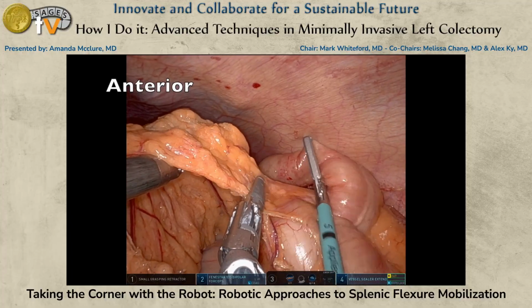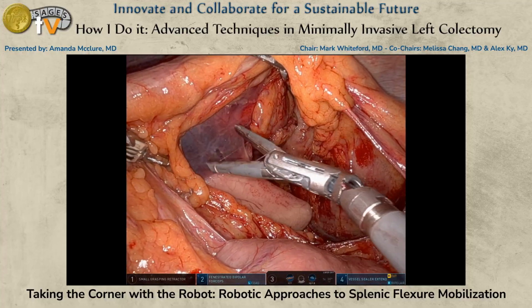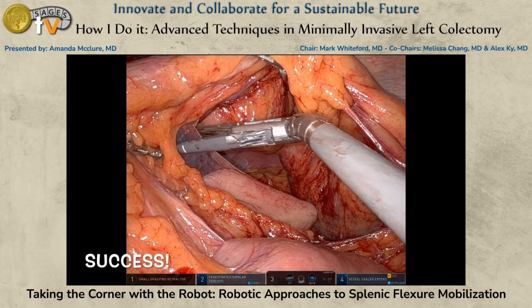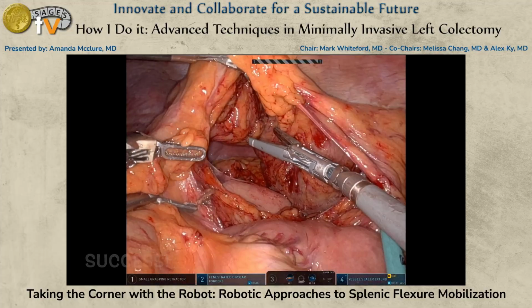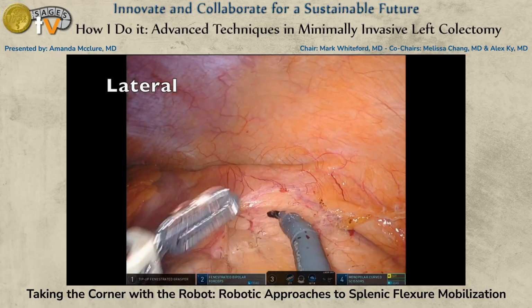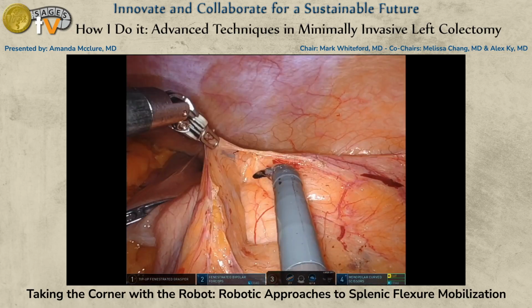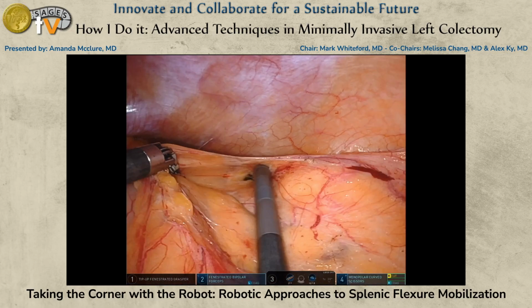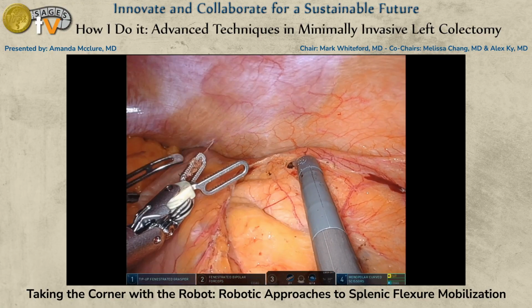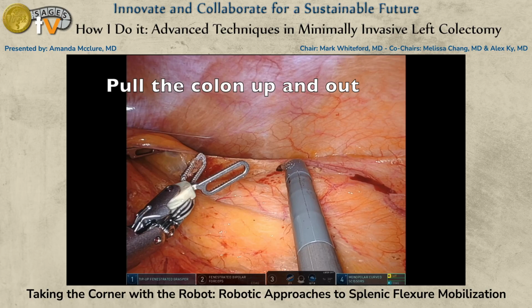So when you flex to the F, and if you look at the top of the boom, there's the FLEX. You can actually move all the arms toward the F. That will go toward flexure. And if you need to move all the arms toward the X, that's the pelvis if you're docked for a left. And so it really gives you extra space to get to that transverse colon. So you can get deep into the middle of the transverse colon by flexing toward the F. So flex towards F for flexure, X towards pelvis, and that will give you extra space if you need it. Create some space with your arms to be able to do that.